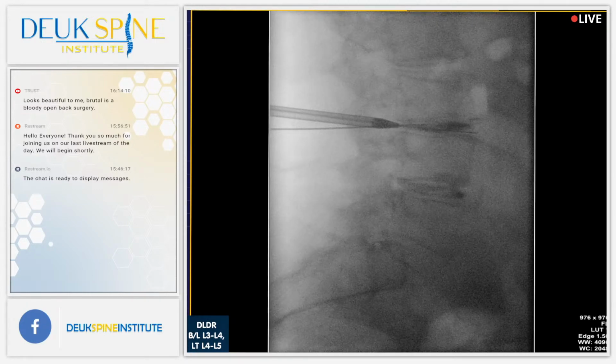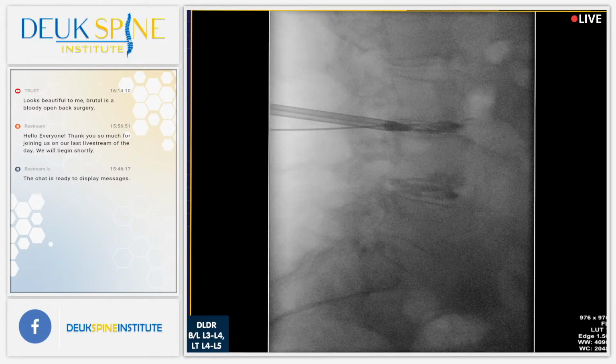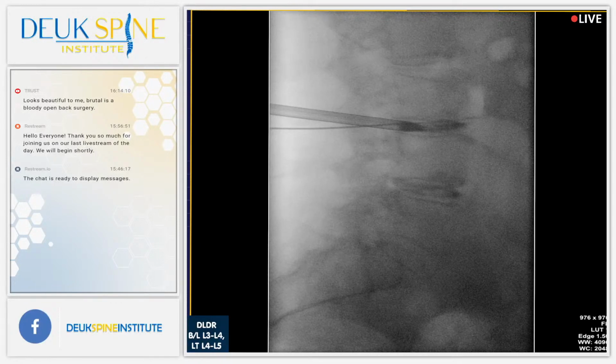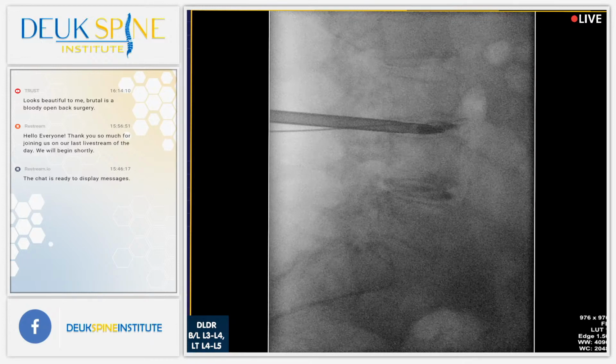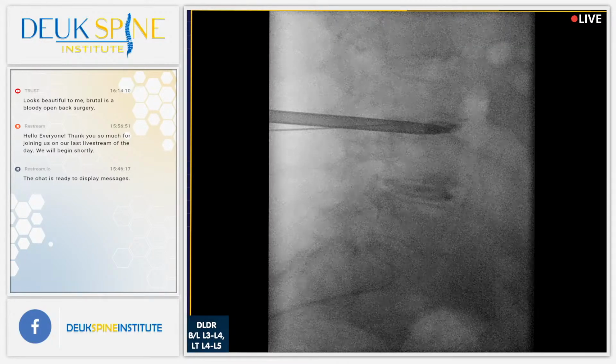What I'm saying is if the part that touches your face is hard, then yes, it needs to mold perfectly. That's what I'm thinking. So with a gel coat, why wouldn't it meld to his face properly? Because of the nose when it protrudes out, it doesn't get the seal. Some patients need a different size. We're just talking about how we can improve on our CPAP mask patient face interface, because you have to remember these masks are not built for prone. They're built for supine. So when we put them prone, you have to get it perfect.